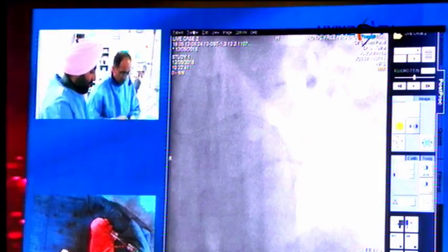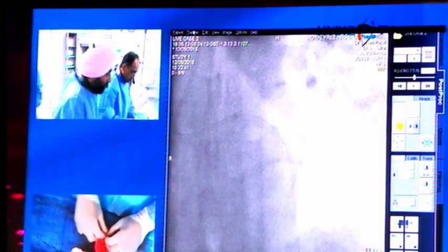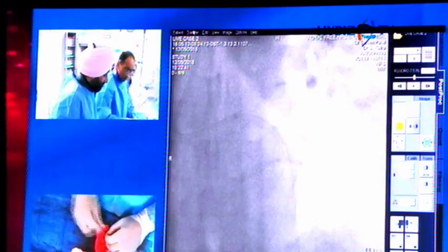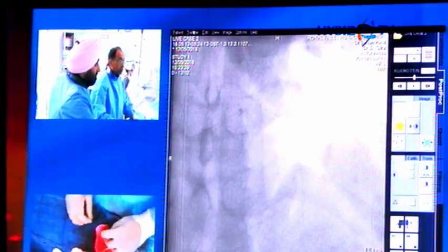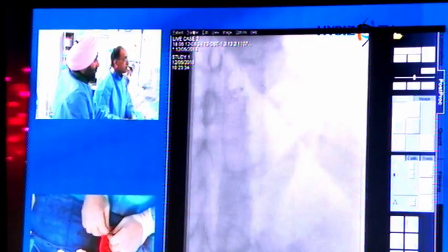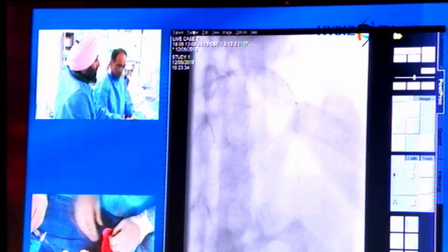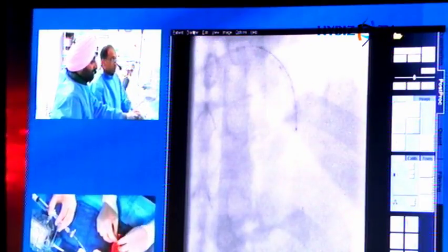Whilst we're getting this OCT ready, if I just ask the panel, do you regularly use OCT to assess adequate stent expansion? Because I think the data's still evolving here. It'd be interesting to see what the data from the forthcoming Illumien 4 trial will show, but do you regularly use OCT to assess for adequate stent expansion? I think it's a little mixed. We just heard some data from the overall India experience on the use of imaging, and it's increasing, but still relatively small. We tend to use a combination of either IVUS or OCT, but imaging as a whole is certainly recommended for overlapping stents in the LAD.